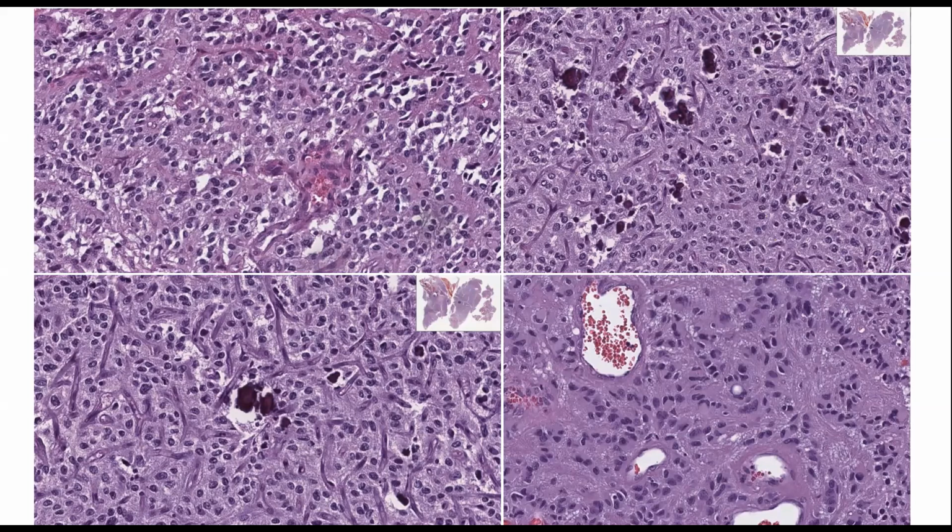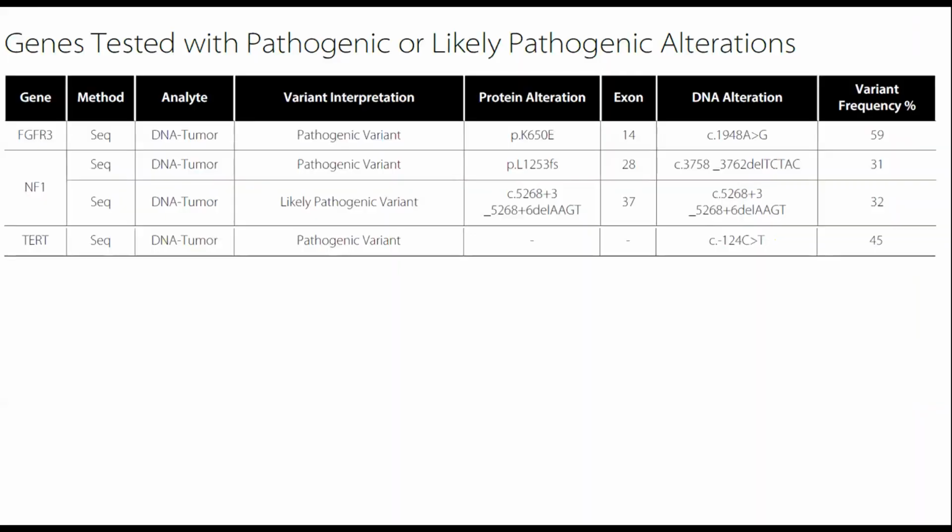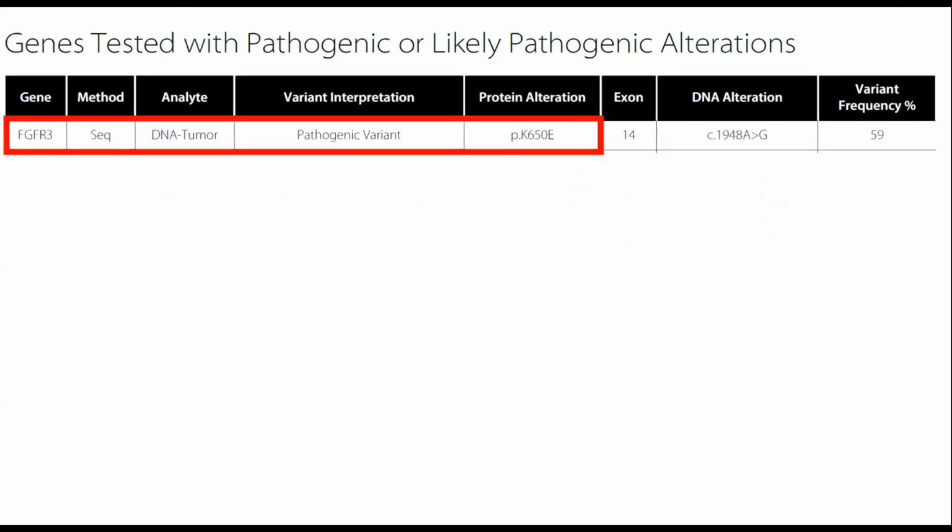And that will be next generation sequencing. All right, so this is the NGS. These are only the altered genes showing you. Let's give you a second to take it in. All right, and now I'm going to make it easier. If you already know, then that's pretty cool. If not, I'm going to help you out with what you should be focusing on.